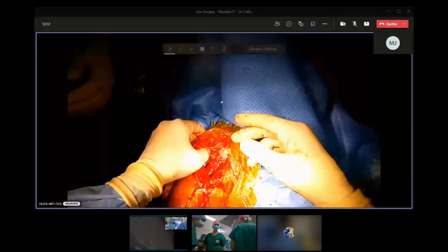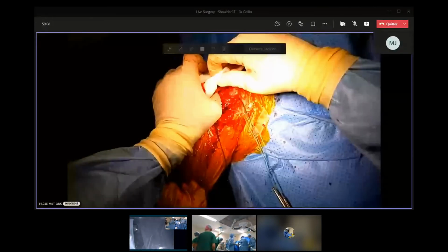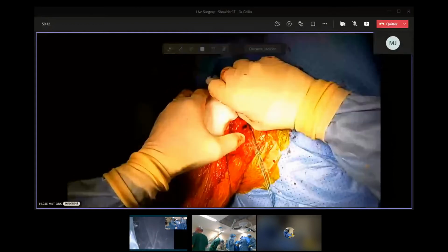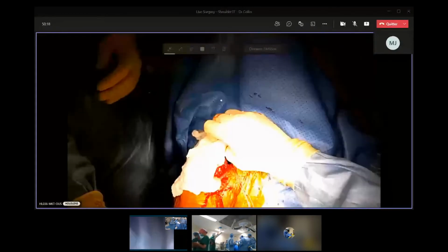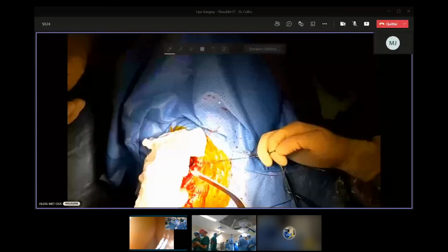So I take this swab. I put it just here in order to protect my deltoid like this. That's very important because the functional prognosis of this prosthesis is based on the deltoid. So you need to protect it. And what I would like to share for you, for the fellow and everybody.